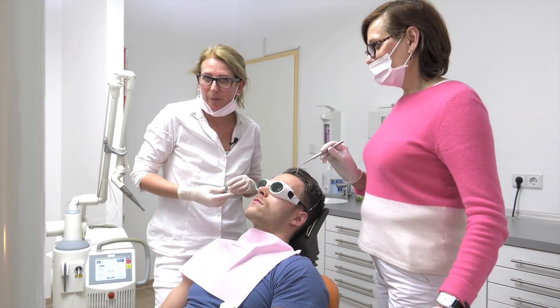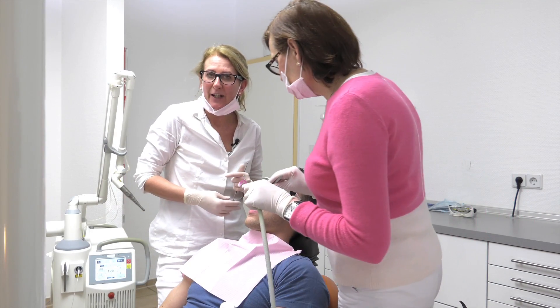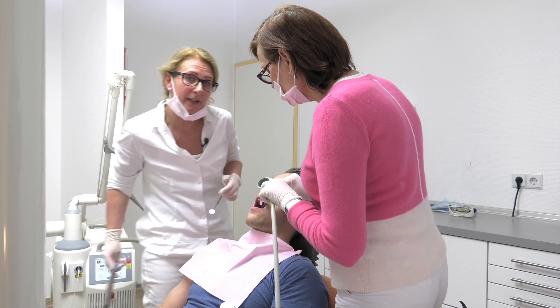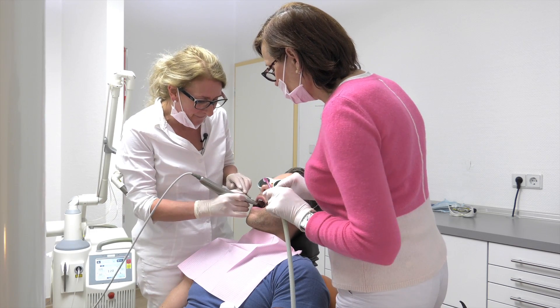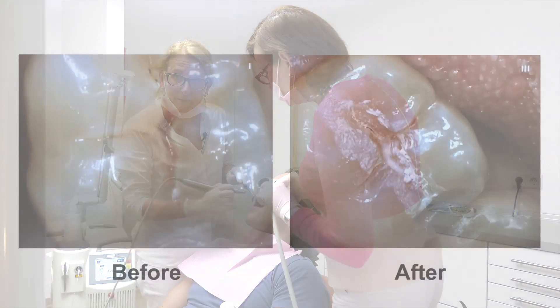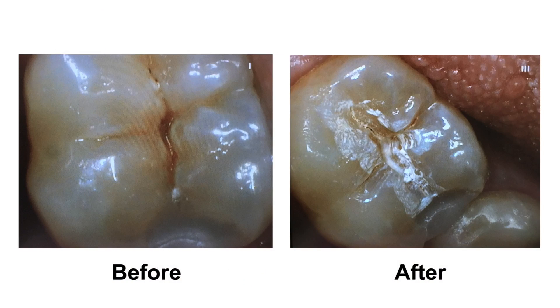The laser preparation is done and I show you in a picture how the preparation looks by using the Erbium YAG laser. And here's the photo. You can see the difference to the drill preparation because the laser takes off each crystal.